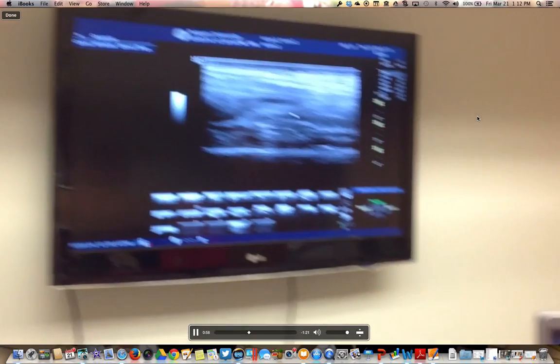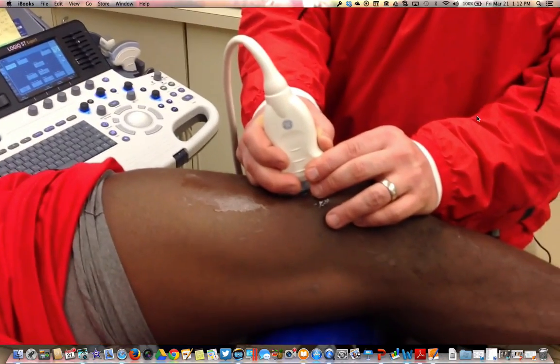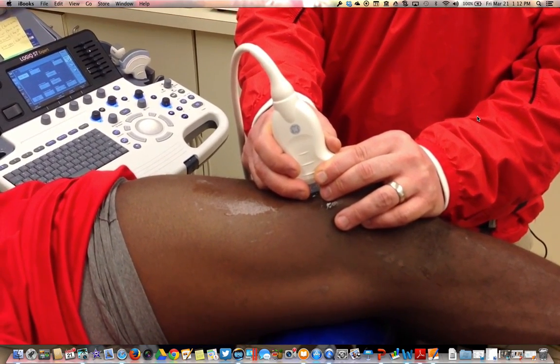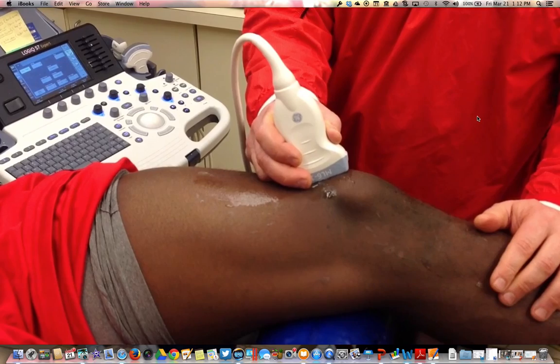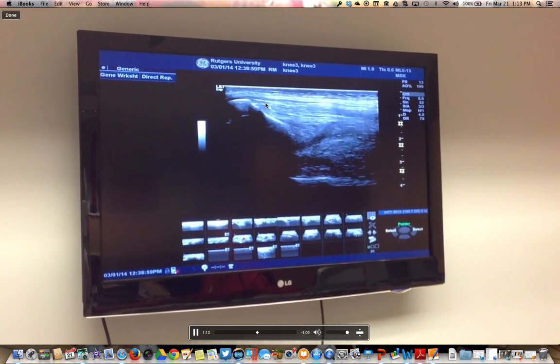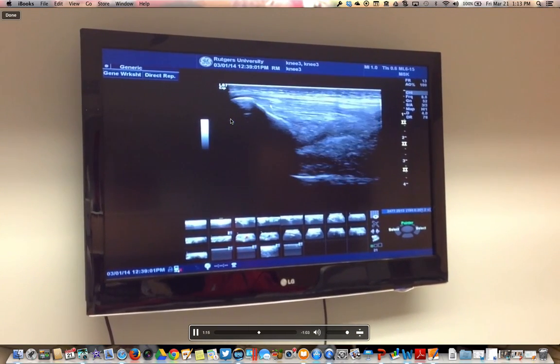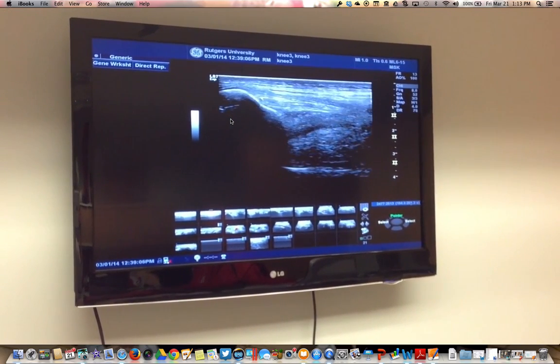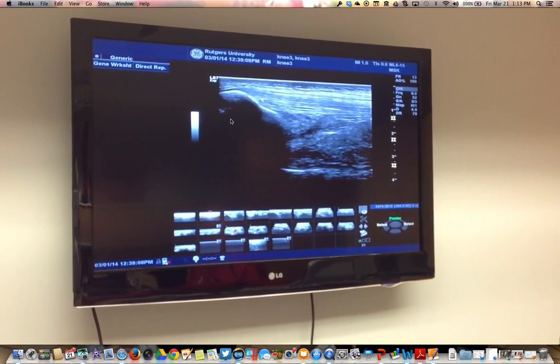We can follow the rectus up as well. We also want to look at this tendon across its width, so make sure you slide all the way laterally. Here you see a small abnormality at the proximal pole in the attachment, which is not uncommon, and then all the way to the medial aspect as well. We'll miss abnormalities if we don't scan across the whole width of the tendon.